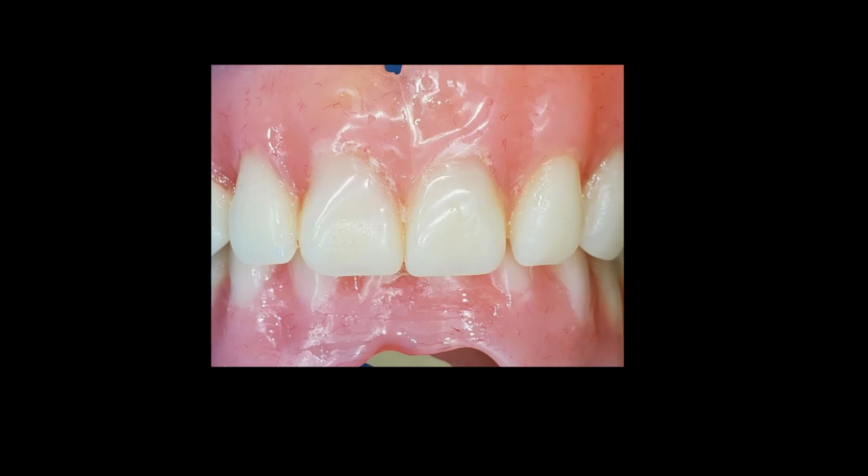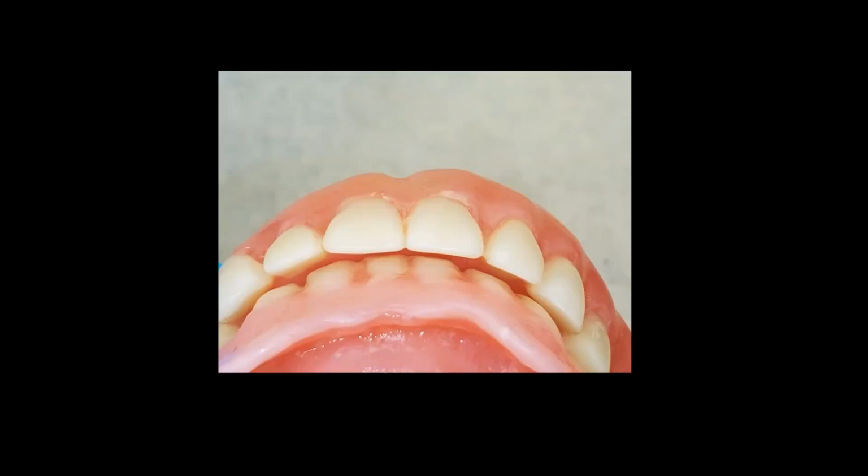So that denture that you just saw, that's what it's like in centric. There's what, 6-7 millimeters of overbite there, but it doesn't present like that in the mouth. So that's what you can do to challenge yourself and start building. I built this to function within her chew cycle, and now I'm able to affect her quality of life in a positive way because I let go and got out of my way.